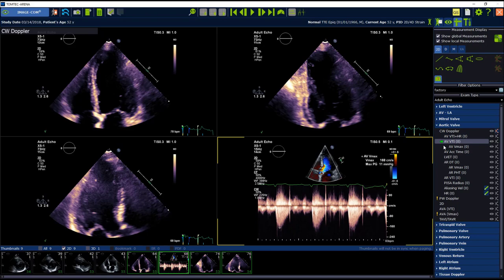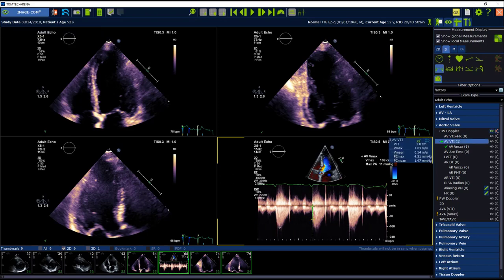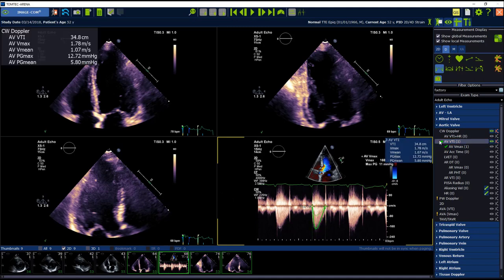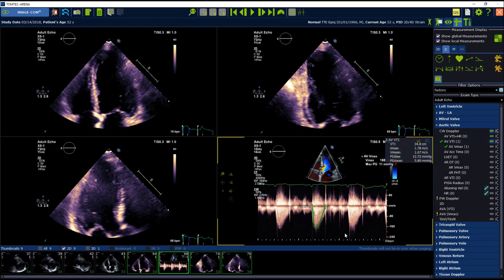Using AVVTi. Start with the left mouse from the base. Left mouse on the tip and right mouse to confirm. After labeling, we can make adjustments if necessary.